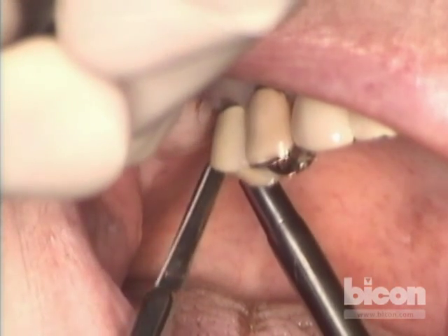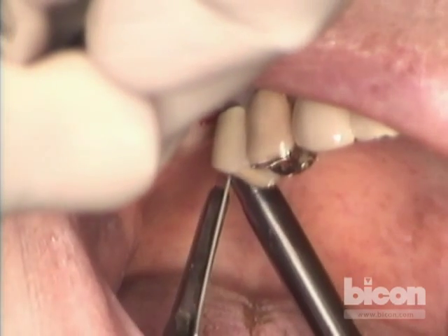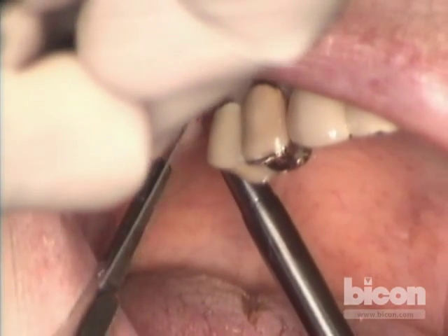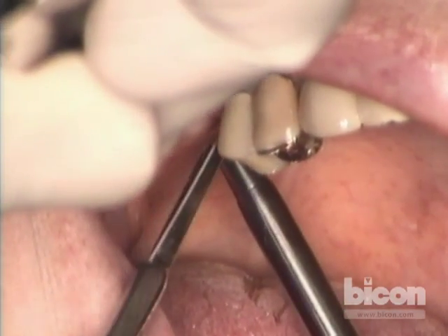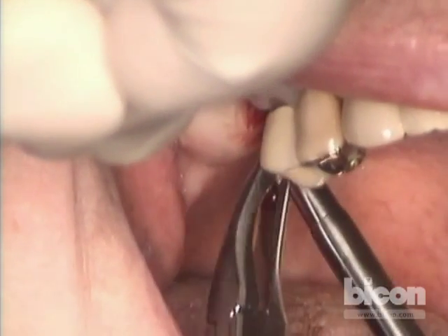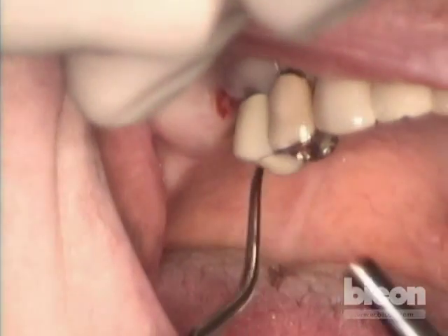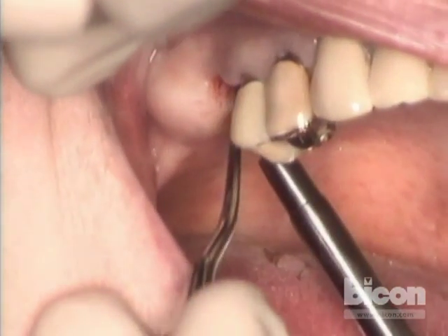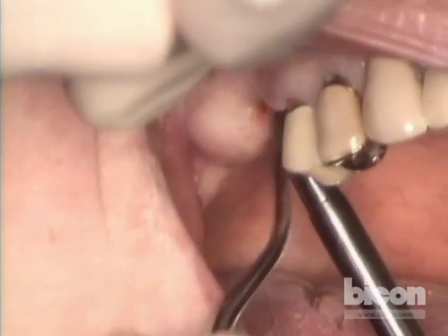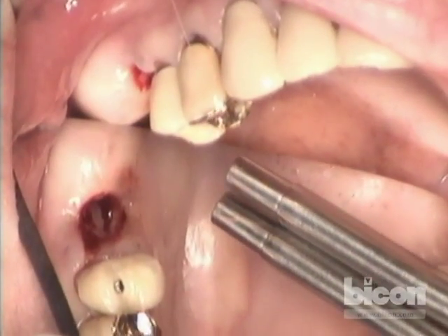Since we don't have full epithelialization, this will be considered an immediate placement — we waited not enough time for either bone regeneration or full epithelialization — so we consider this an immediate post-extraction placement. We take a soft tissue rongeur after making a circular incision around the perimeter of the socket, and we remove all of this friable pre-epithelium type soft tissue and any remnants that may be too mobile, because ultimately we want to feel bone contact. You can see how we've freshened the socket into a circular shape, which will be much easier to fit with a healing abutment.